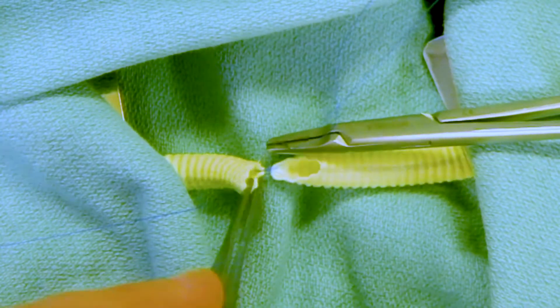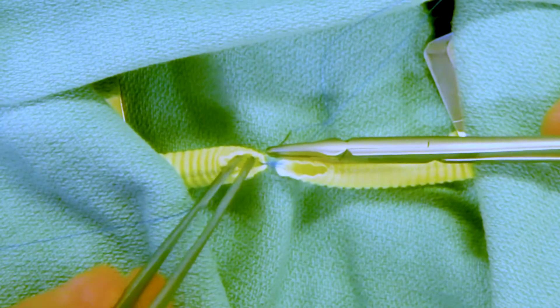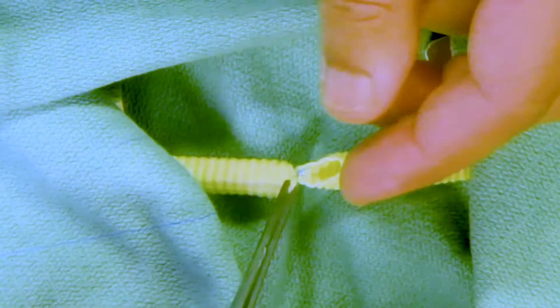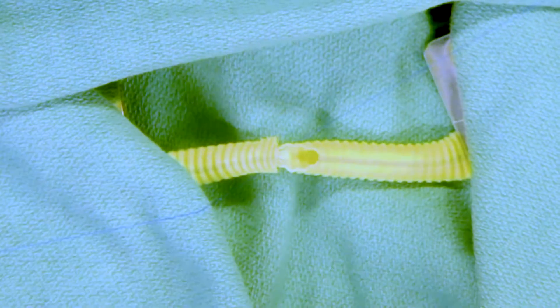As each throw is done, we're careful not to leave the needle tip inside the vessel, but instead to aim for the open space outside of the blood vessel. And we generally will pull up when the suture is on the outside of the vessel, such that we evert the edges.